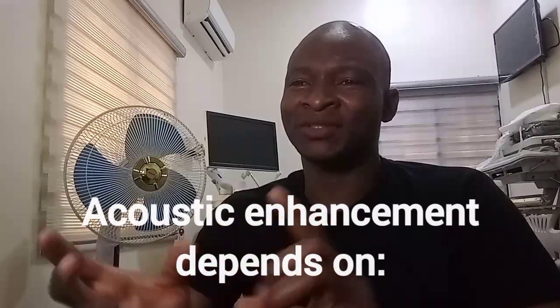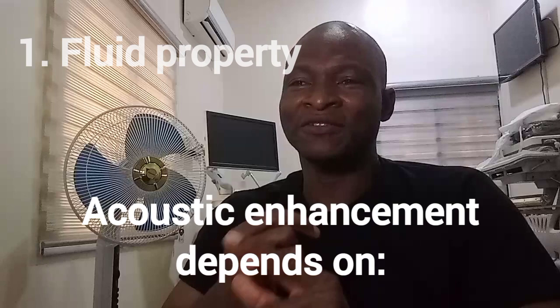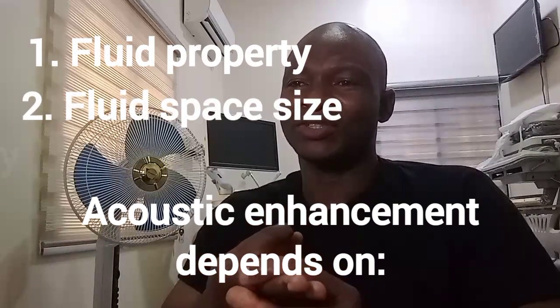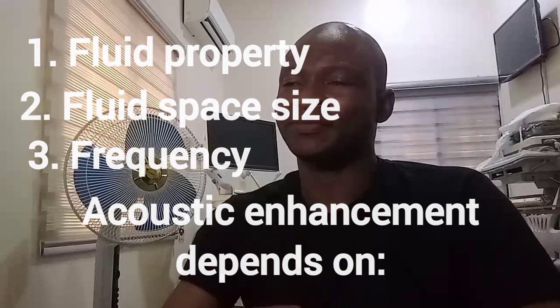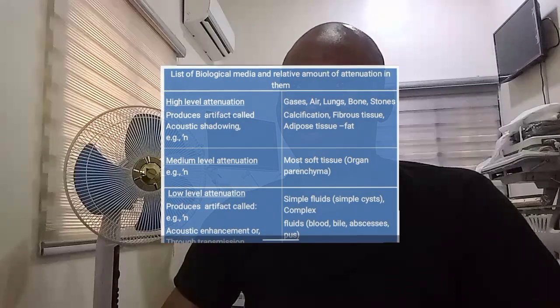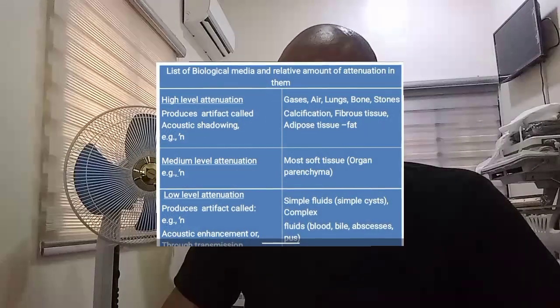The degree of acoustic enhancement is dependent on attenuation property of the fluid, the size of the fluid space, and transducer frequency. This table shows us a list of biological media and relative amount of attenuation in them. You have high level attenuation.